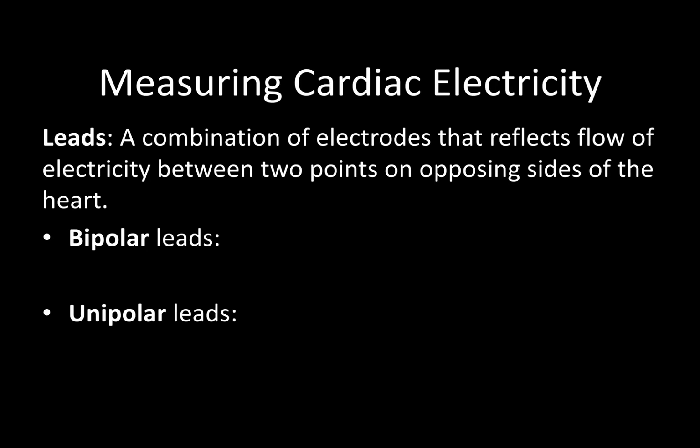So we've put all these stickers on the patient. What good does that do us? Well, we have to measure that cardiac electricity. And so leads are a combination of these electrodes to reflect the flow of electricity between those 2 points on opposite sides of the heart. Really fancy way to say, we put a positive and a negative and see how much electricity is flowing between those 2 spots.